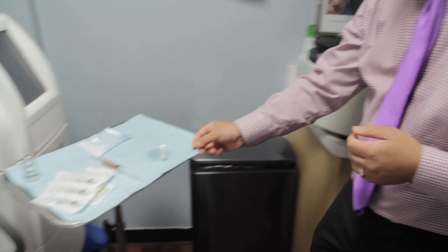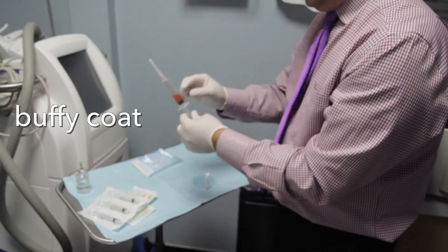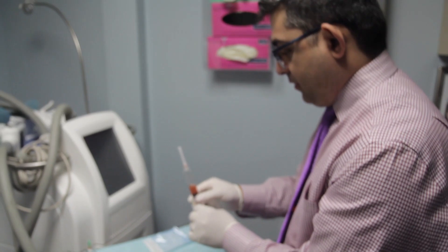We have already done the PRP procedure on our patient, so I'm just going to show this to you. This is the buffy coat. Sometimes it's a little bit yellower, sometimes it's a little bit darker — it depends upon the individual.